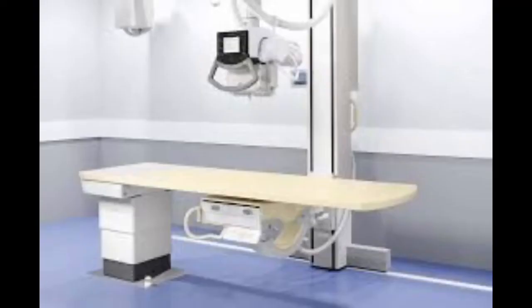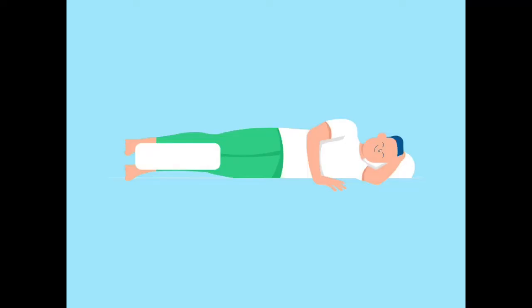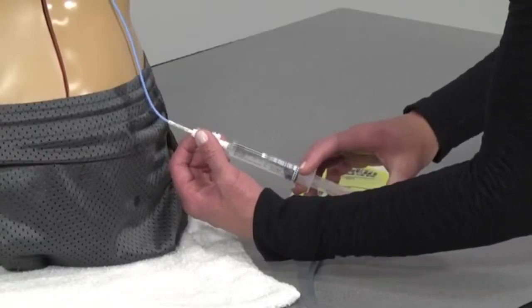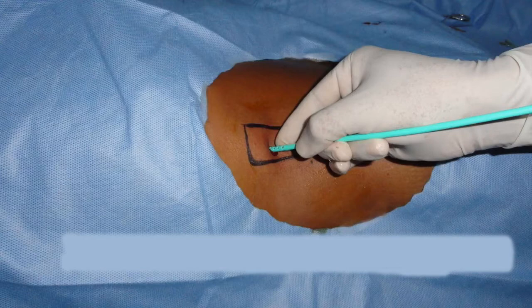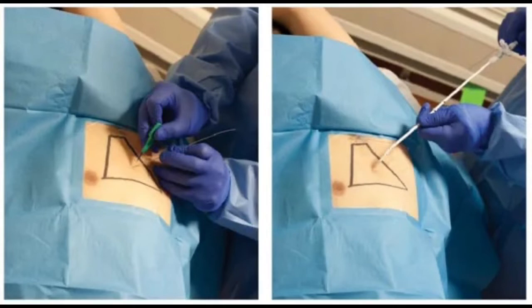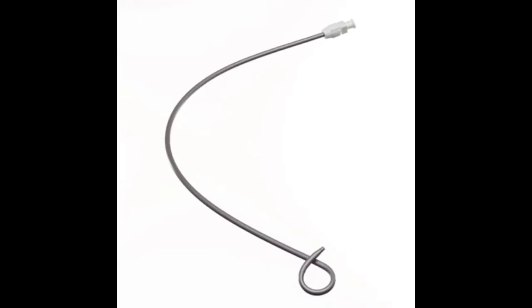The procedure is carried out while you are lying on a special X-ray pad on your stomach or slightly on your side. Sedation and pain relief will normally be injected at this time. Once the position is confirmed by a doctor, a wire is placed through the needle and the needle is removed. The nephrostomy tube is then inserted over the wire, and then the wire is removed. The tube is then locked in position by pulling and fastening a string that causes the end to curl into what we call a pigtail appearance.